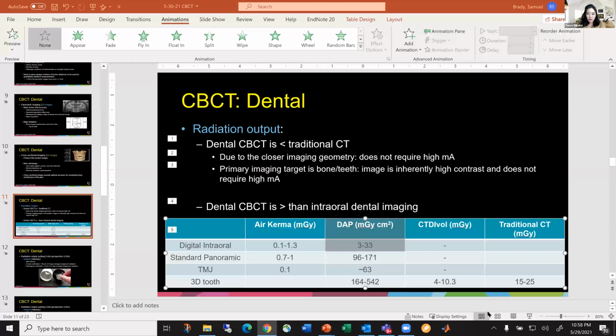So there is another question from the Facebook Live. When we do the fluoroscopy in the IR suite with cone beam CT, is there any heat issue? Heat, that issue can happen? Heat. I mean, because when you do fluoroscopy and cone beam CT, maybe in one patient you do multiple spins for the cone beam CT.